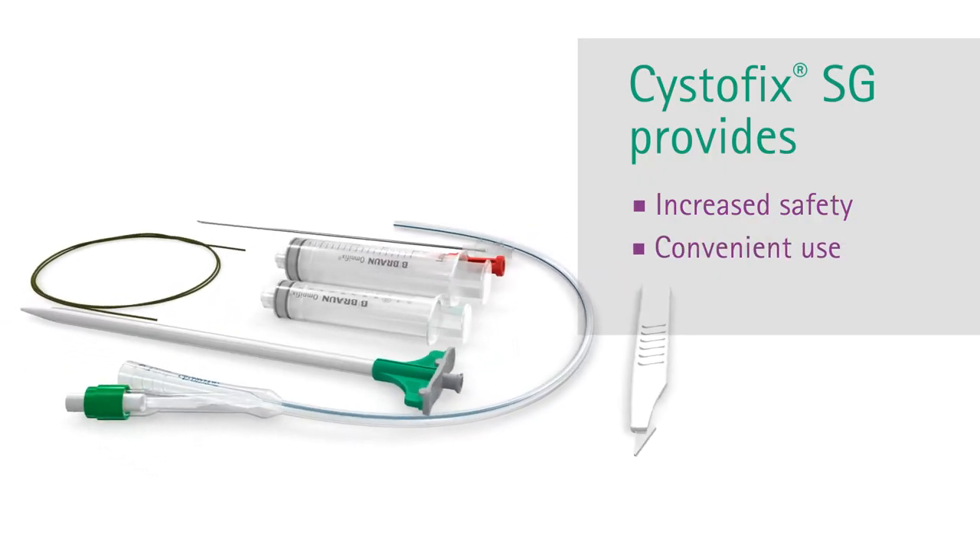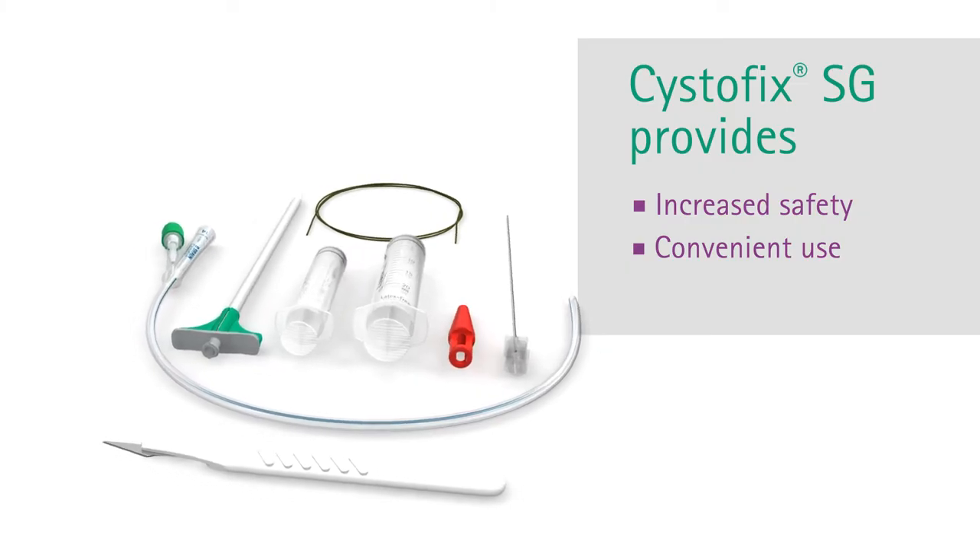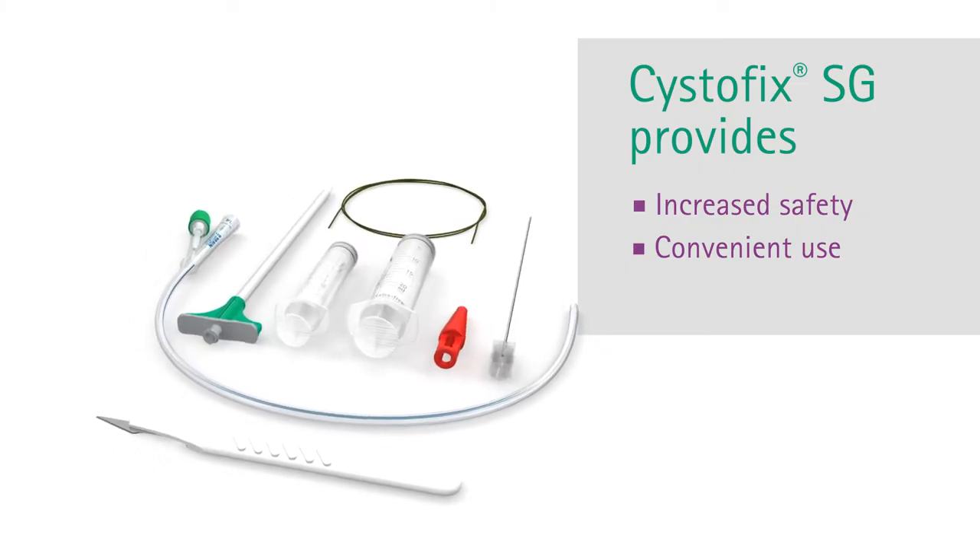The new Systofix SG is convenient to use, as it permits the use of local anesthesia in the endoscopy room. You can place catheters up to 16 charrier.